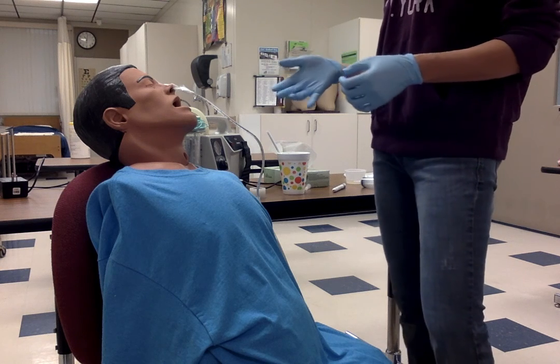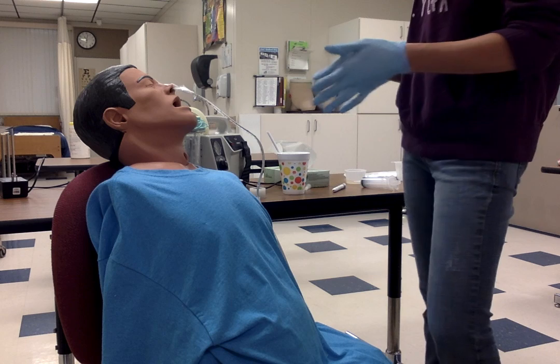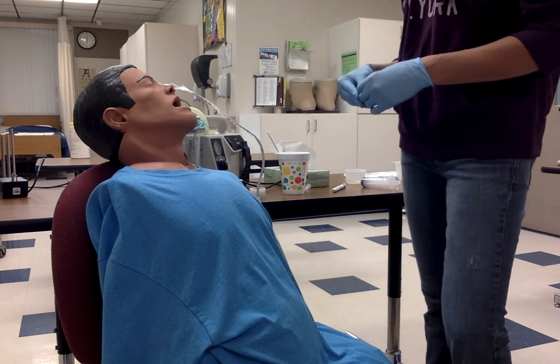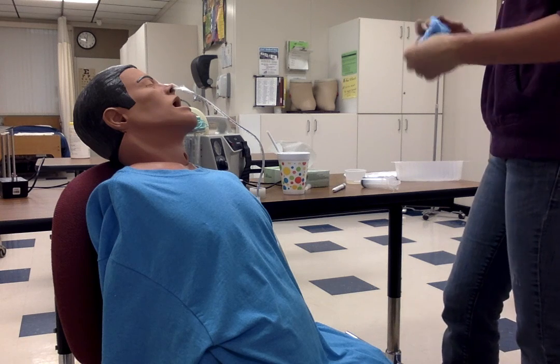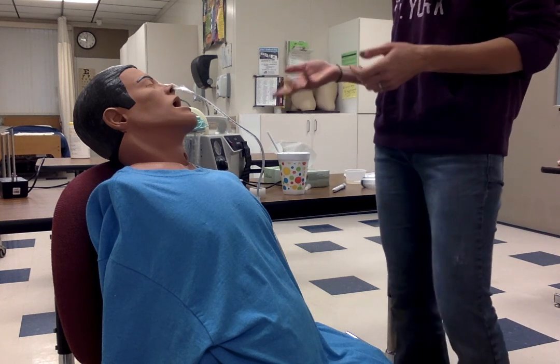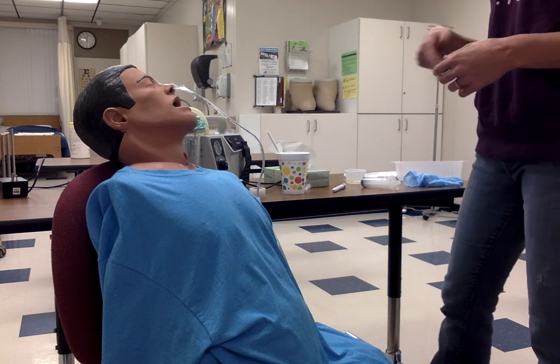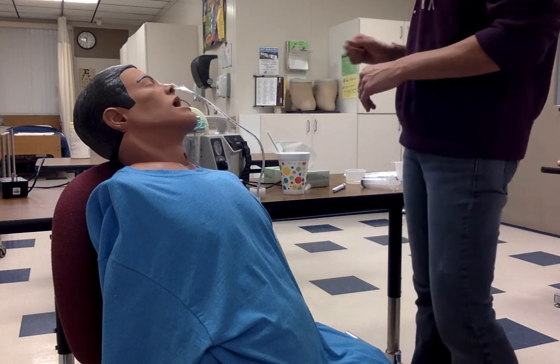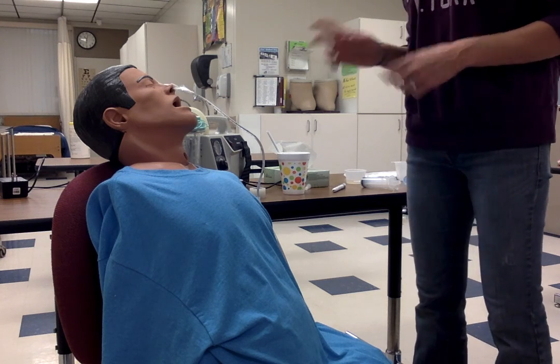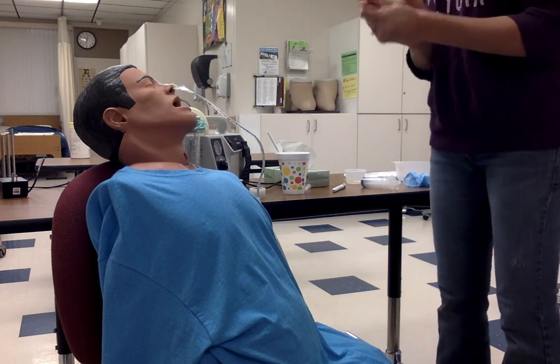That you have the NG tube placed. Now they'll come up to get the x-ray to confirm the placement of that. So I'm going to go ahead and take my gloves off. We do have tissues here if the patient were to need to wipe their nose, or if they were kind of drooling from it going down their throat. We do have that here. So I'm going to go ahead and document. I'm going to wash my hands here. And then that completes the skill.